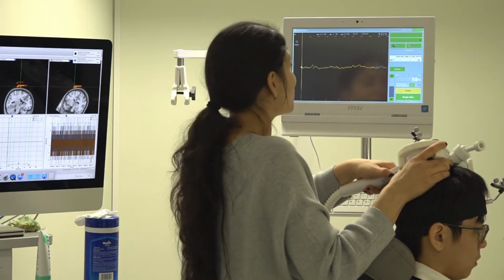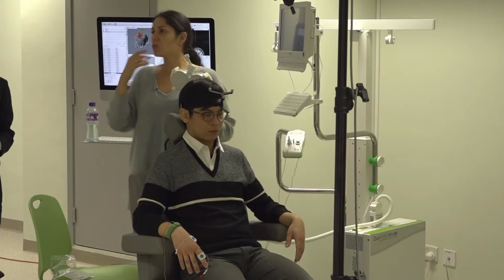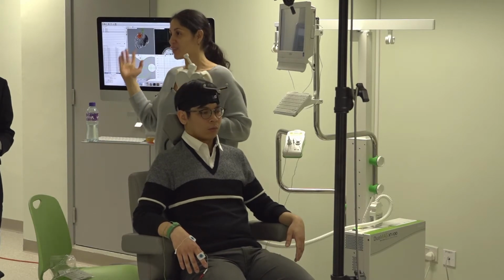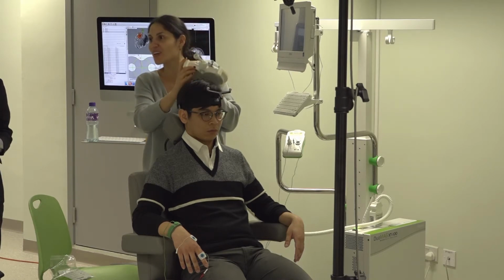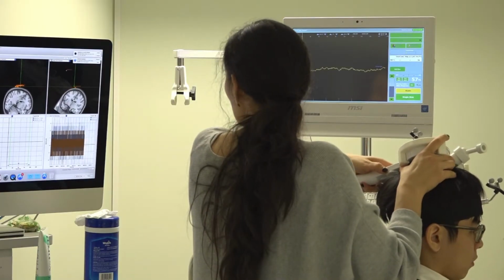It's really tiring to see the back. This should be in front. So when you plan your lab, try to make it in a way that the screens are all in front so the experimenter can see the screens, because this is just not working, right? I'm looking and then I'm moving the coil. So it's not the best way.